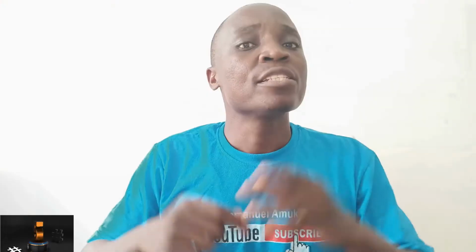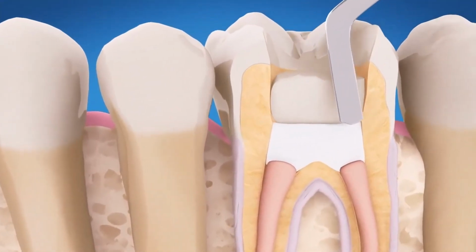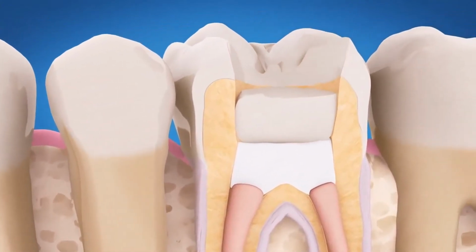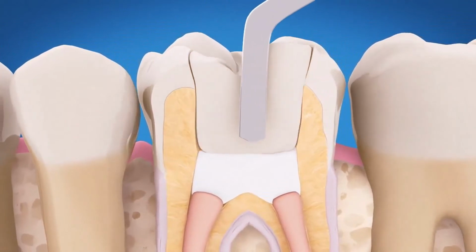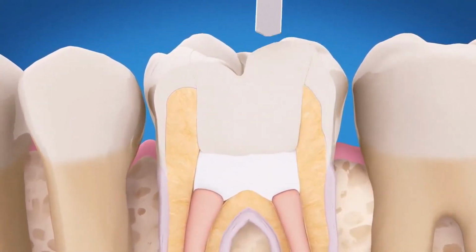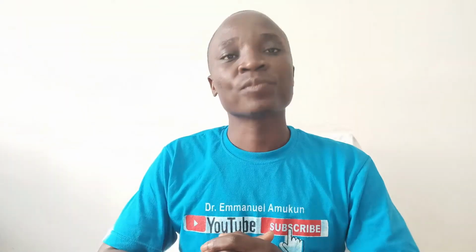Step number 5. We now refill the cavity where we have been cleaning, and that's what we normally call restoring the tooth. So we refill it completely to cover the hole so that it regains its shape.